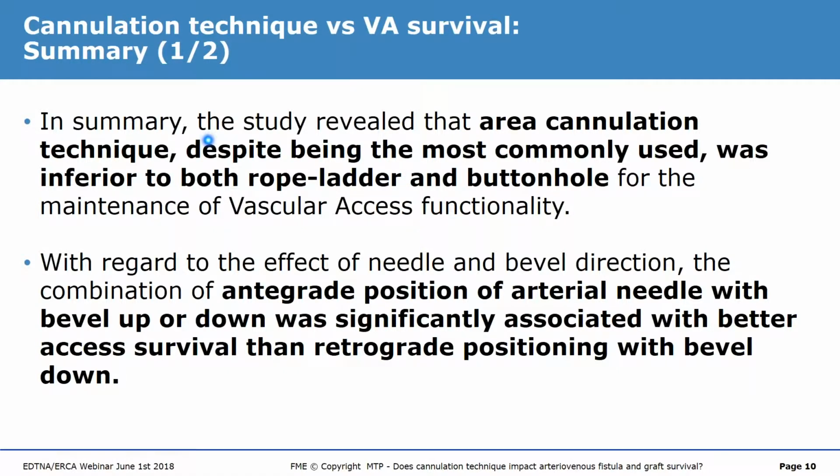I just want to mention that what in Europe is called area technique, in the United States or North America, let's say, Canada included, they call it one-site itis. So in Europe, we call it area technique. In the United States, in Canada, one-site itis.